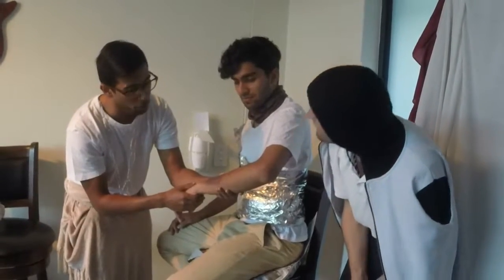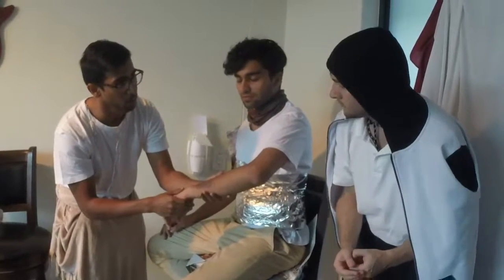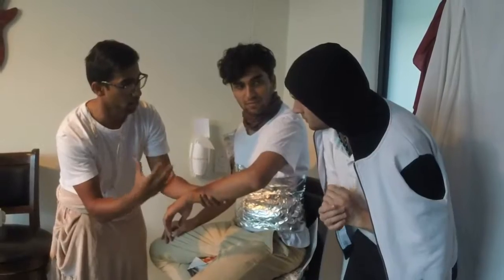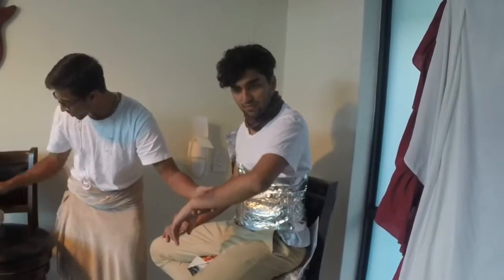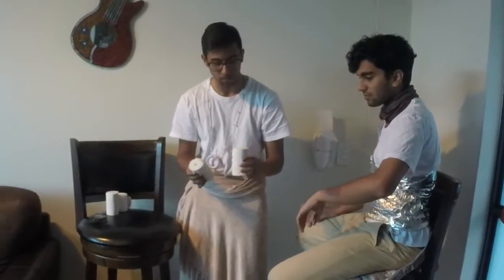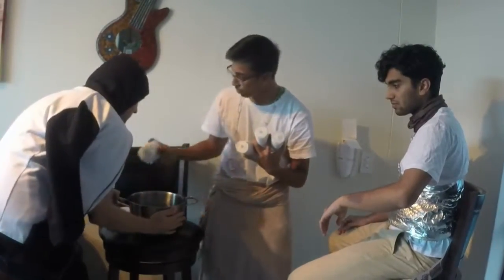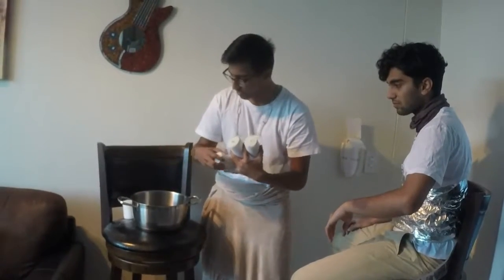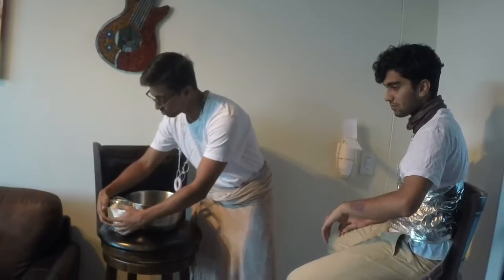Fetch me a bowl of water please. It shouldn't be too hot - it should be about room temperature, fairly tempered. The warmer the water is, the faster the cast hardens. We want to have a little bit of time to work with it. Over here I have my three rolls of 100 millimetre wide plaster of Paris, as well as one roll of 100 millimetre wide felt band. It's important to have at least three layers of plaster of Paris in order to ensure sufficient strength.